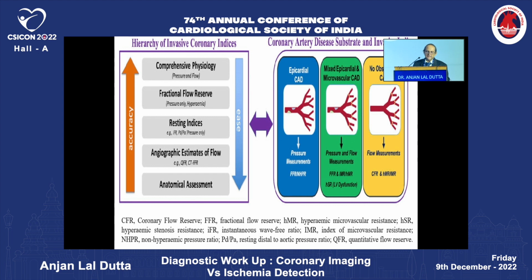The resting indices, again PdPa, because in FFR or in investigations like this, where we are going to detect the difference in the proximal and distal end of a diseased portion, apart from FFR, we can induce the difference by injecting adenosine or other hyperemic agent so that we find out the difference quite easily rather than waiting for what is going to happen.